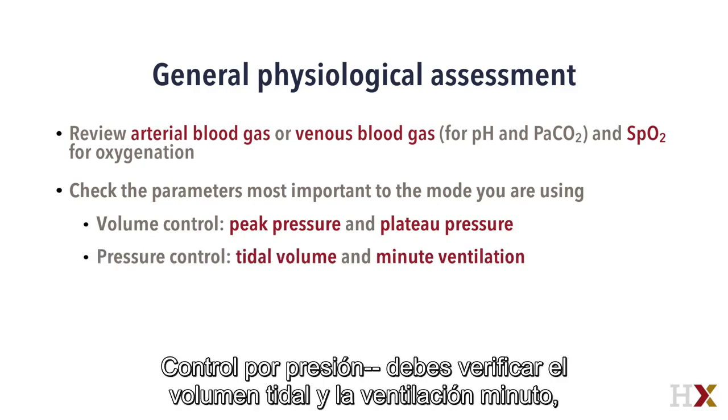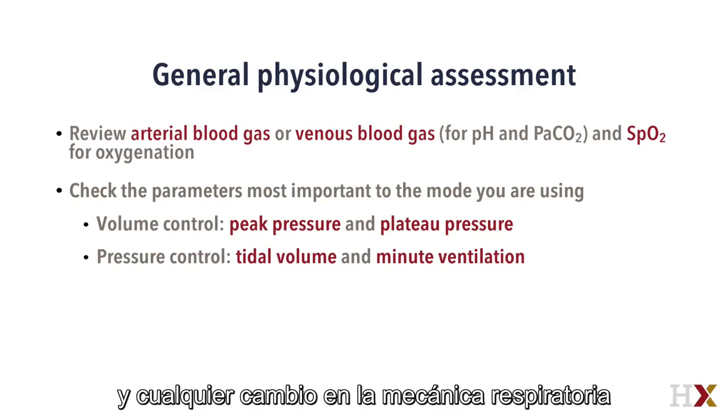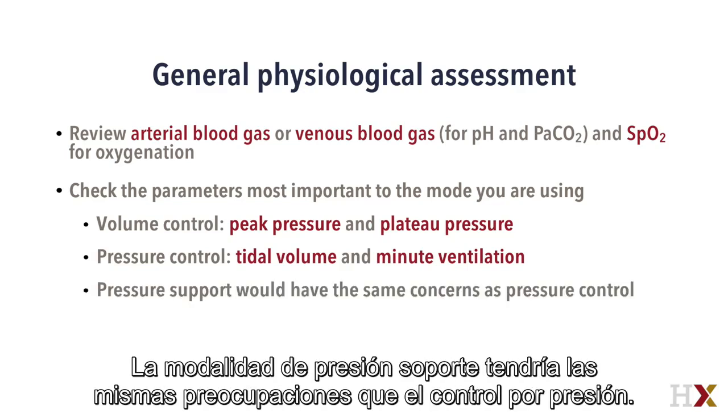In pressure control, you need to check the tidal volume and minute ventilation, since pressures would not have changed since the last time you saw the patient, and any change in respiratory system mechanics would alter tidal volume and minute ventilation. Pressure support would have the same concerns as pressure control.